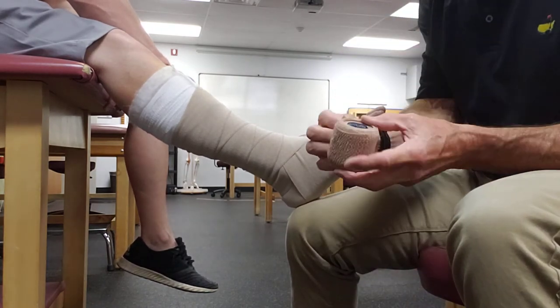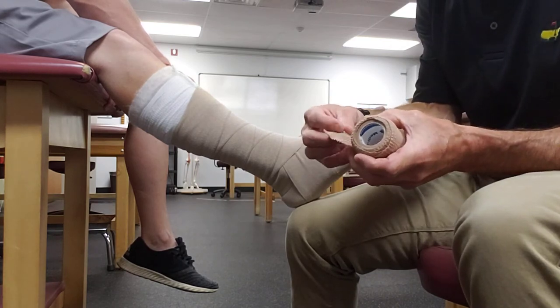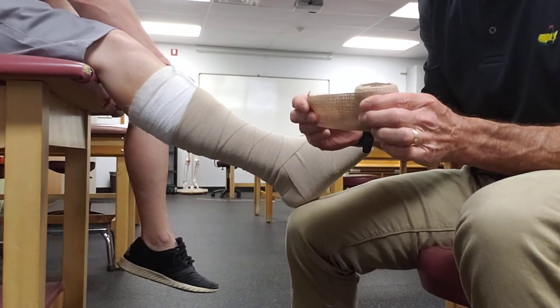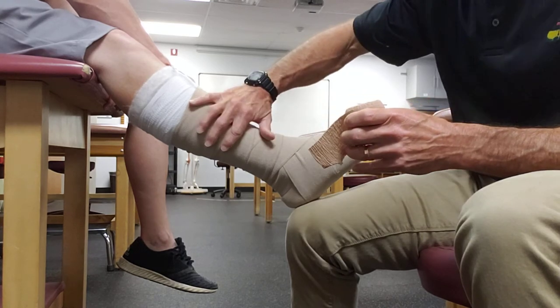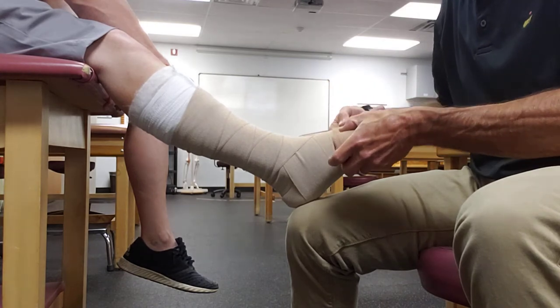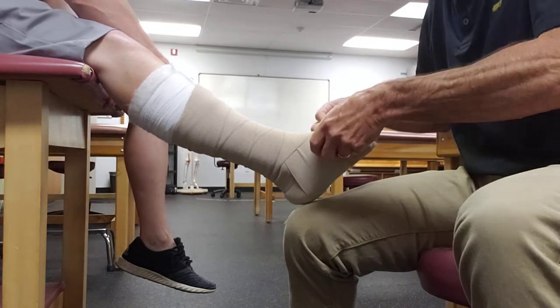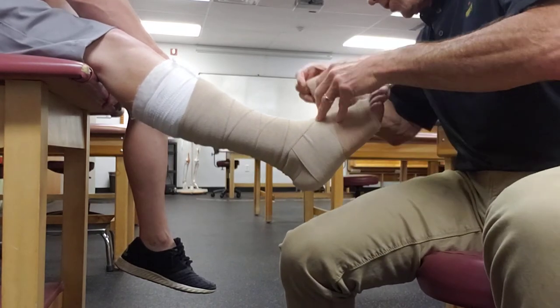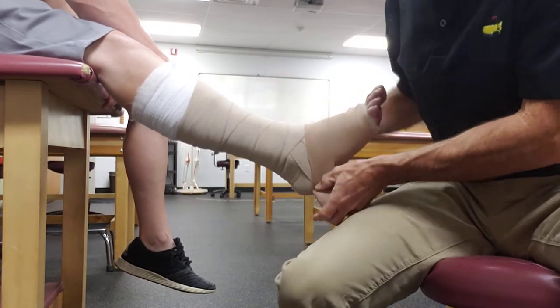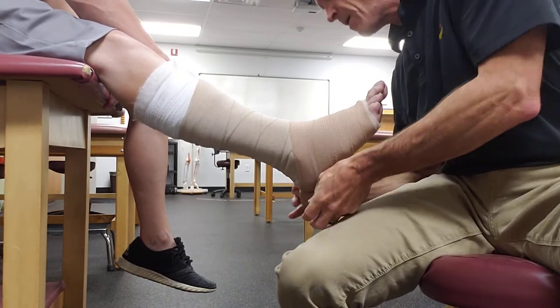The fourth layer is Coban — which stands for cohesive dressing. It does have elasticity, but the reason we use it is really just to hold the true compressive layer in place so it doesn't unravel or shift around. You don't need to do this in a figure-of-eight, and you don't want to stretch it a whole lot — just spiral it up the leg, making sure you're not leaving any spots uncovered.